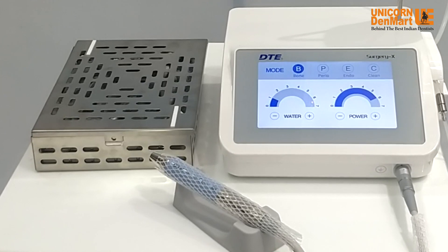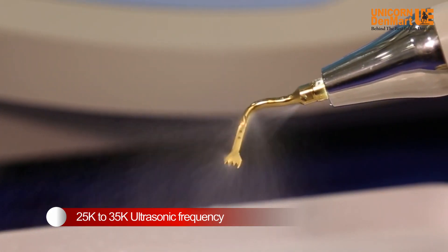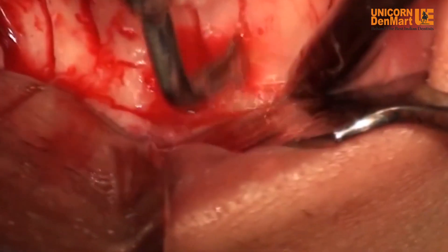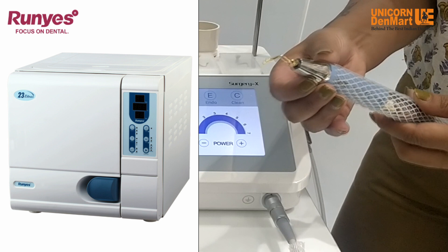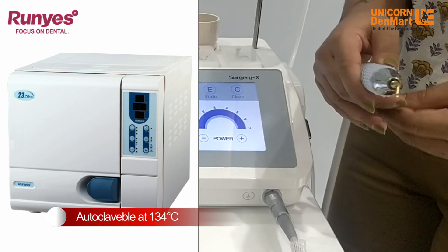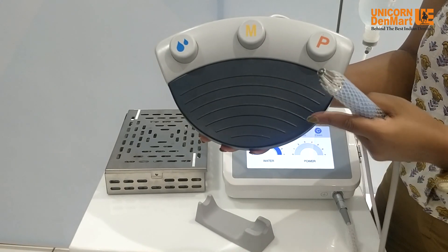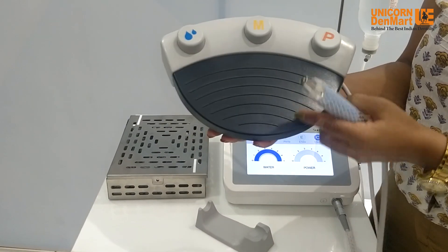The unit operates at 25,000 to 35,000 ultrasonic frequency generated at the tip, precisely cutting bone without overheating. Handpieces are safely autoclavable at 134 degrees Celsius in a B-class autoclave. Surgery X has a multi-functional foot control for hands-free operations.